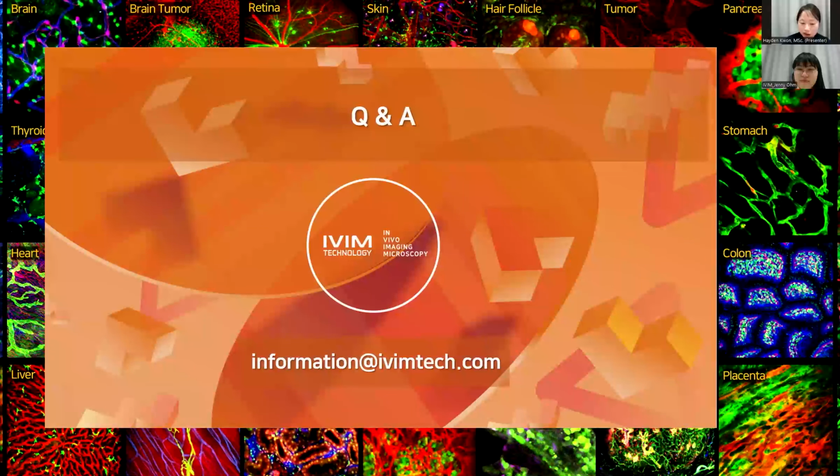But in terms of lung imaging, we need to open the chest wall by cutting the skin and also several ribs. In this case, the duration of the lung imaging will be 4 hours or 6 hours. I hope you understand that opening the chest wall is quite harmful to the mouse.